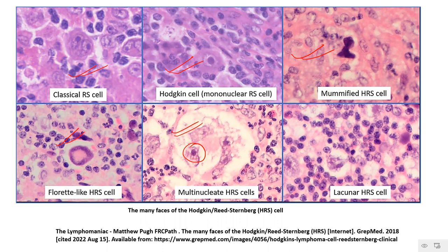And in the case of the nodular sclerosis Hodgkin lymphoma, you would have these Hodgkin-Reed-Sternberg cells lying within a lacuna, within a clear space. Now, this is a formalin fixation artifact, which might not be seen with B5-like mercury-based fixatives.